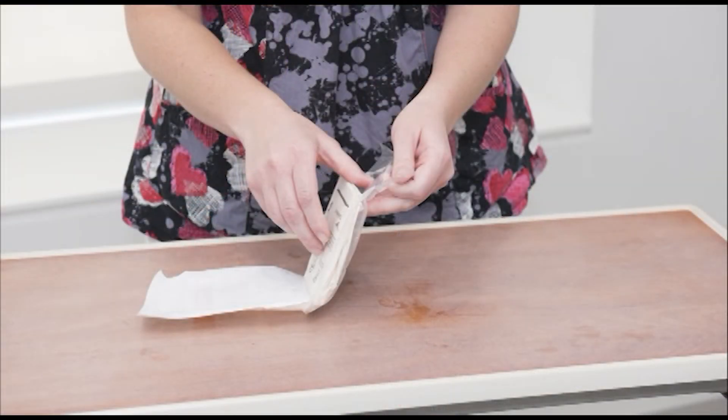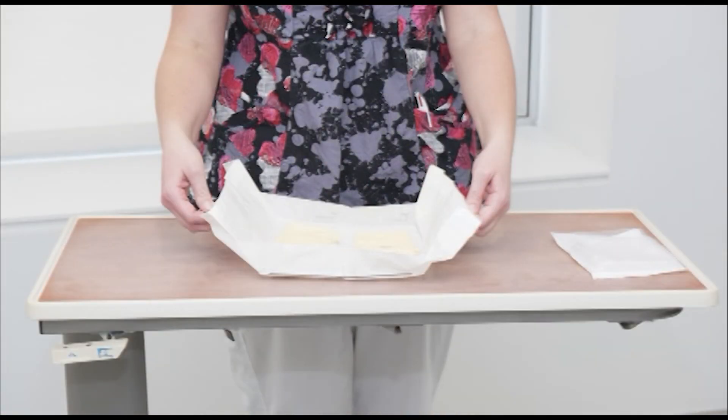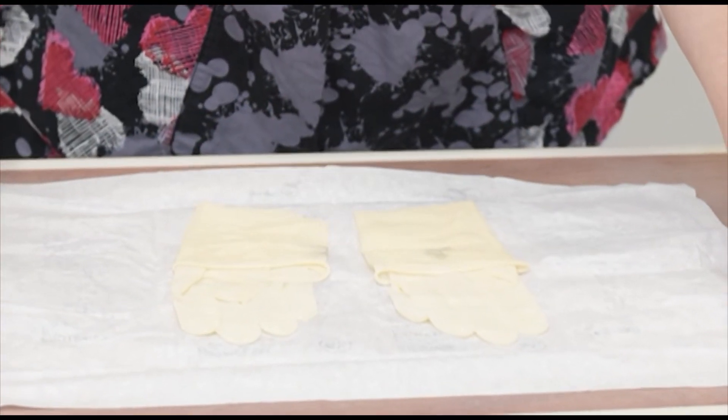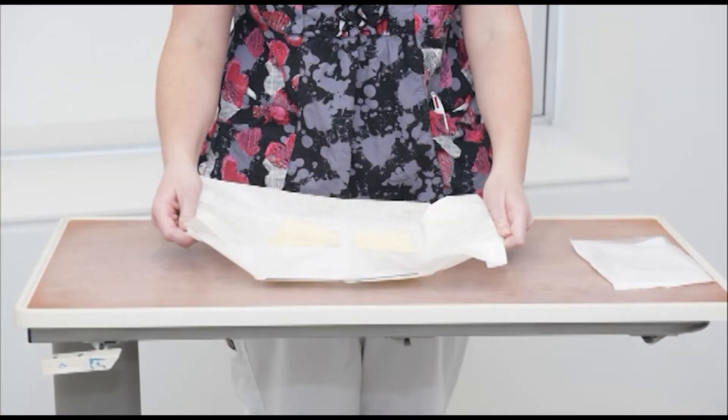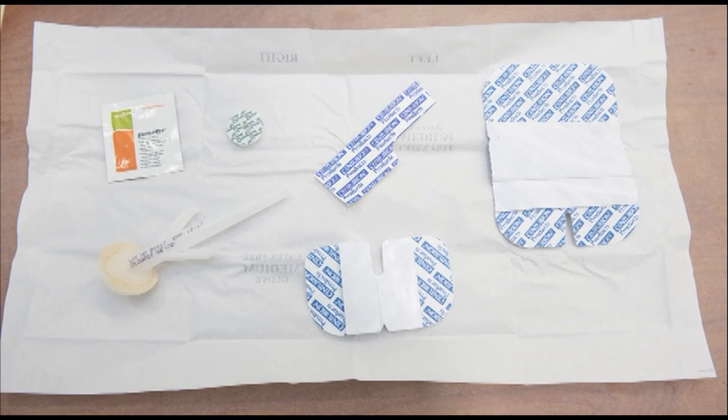Remove the wrapped sterile gloves from the package and place it on your work area. Open the gloves carefully to make sure they remain sterile, and look over to ensure that there is no damage to the gloves. Only the outer borders of the package — one inch around — can be touched by your non-gloved fingers. The wrapper from the sterile gloves will be your sterile field when working with central line supplies.